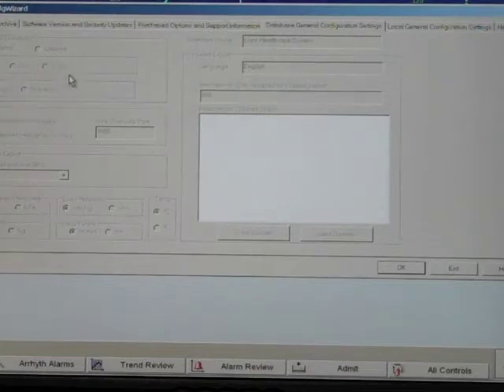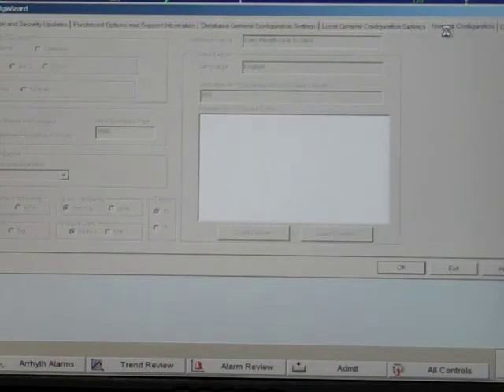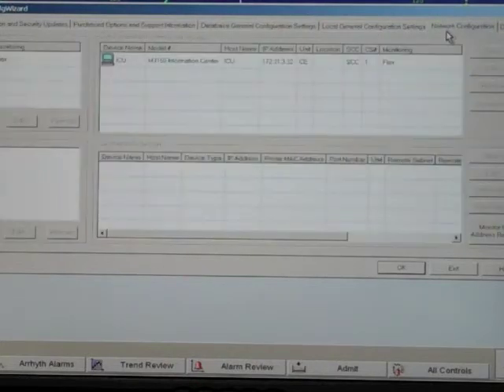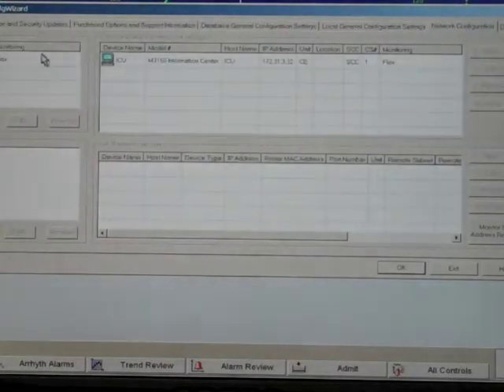Now click on the network configuration tab. In this tab, verify that the unit is set to flex.